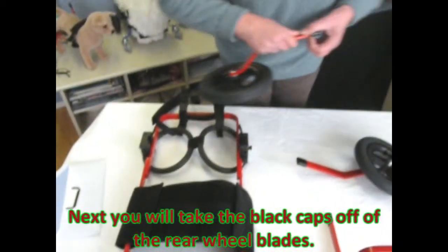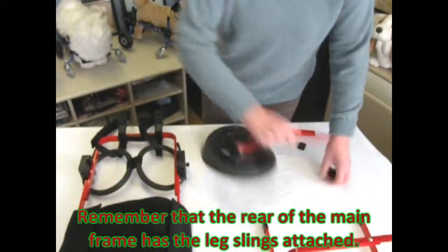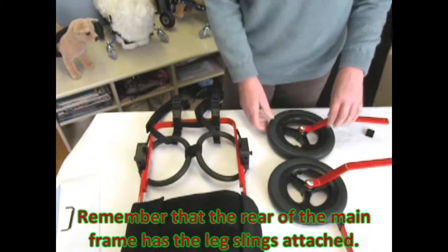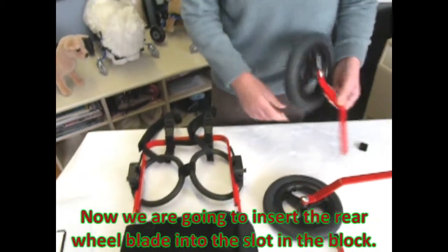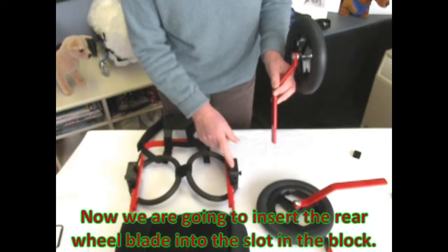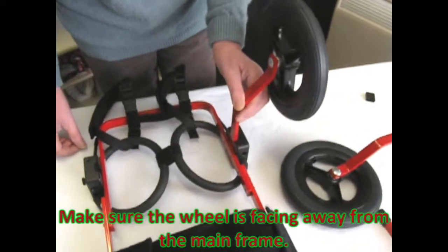Next you will take the black caps off of the rear wheel blades. Remember that the rear of the mainframe has the leg slings attached. Now we are going to insert the rear wheel blade into the slot in the block. Make sure the wheel is facing away from the mainframe.